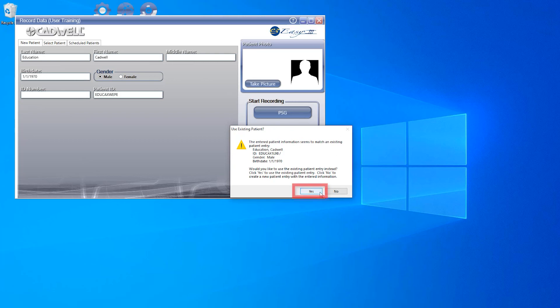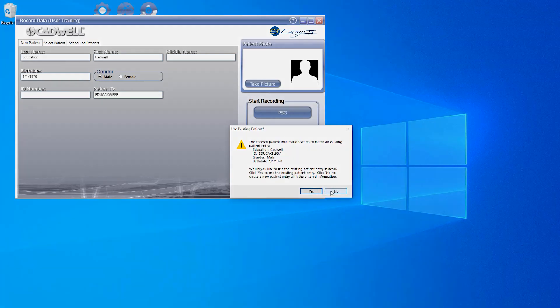This will use the existing patient information. If you determine the patient information is not the same, click No and you will create a new patient.